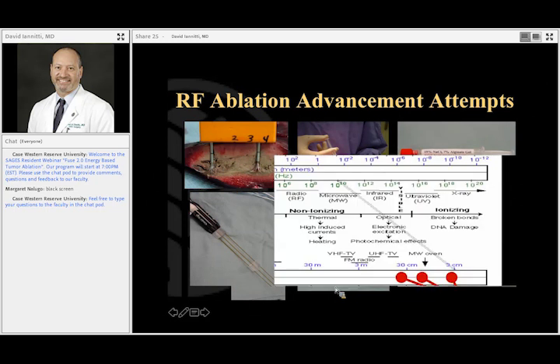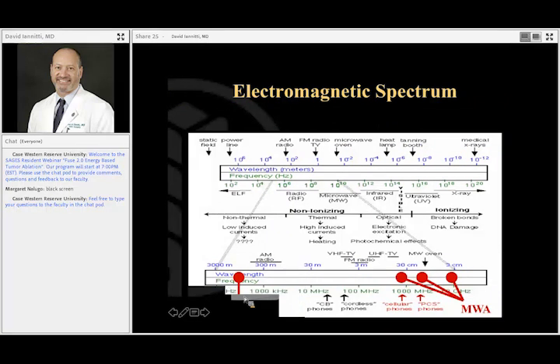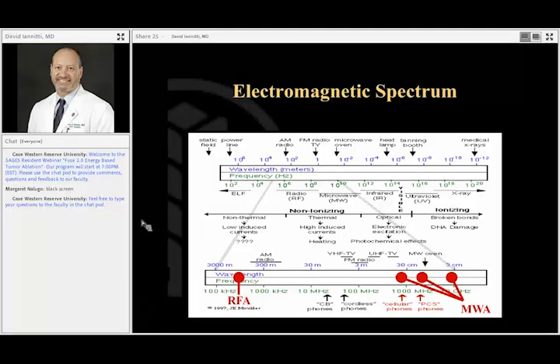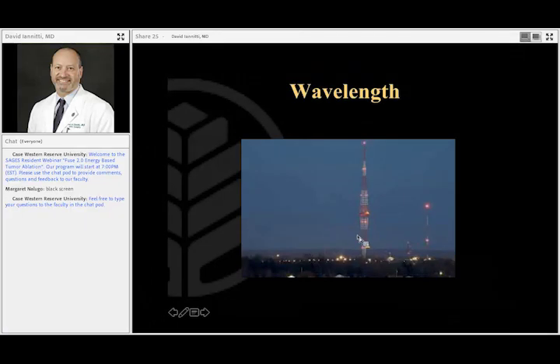So let's take a step back and look at the energies we're talking about. This is the electromagnetic spectrum, and on the left side is radiofrequency, so AM radio, which is about 460 to 480 kilohertz. When you think about that frequency and the wavelength, those are massive wavelengths. These are a couple of AM antennas, and those wavelengths are hundreds of meters long.